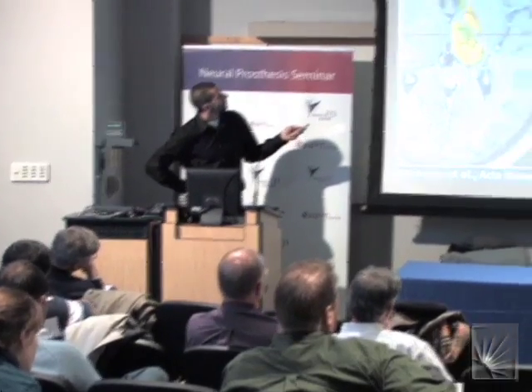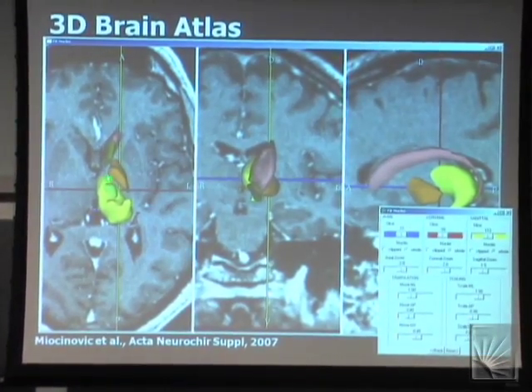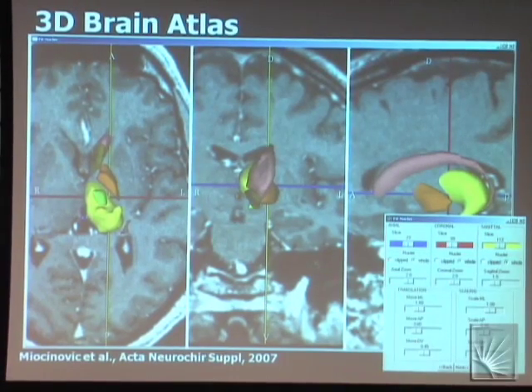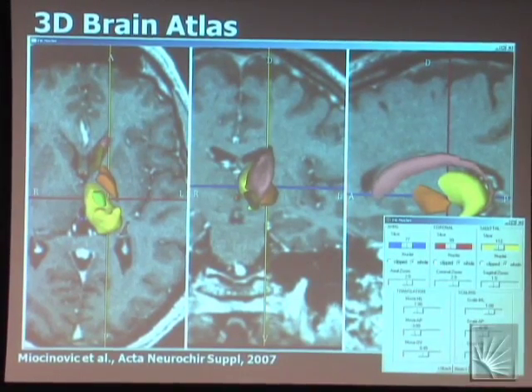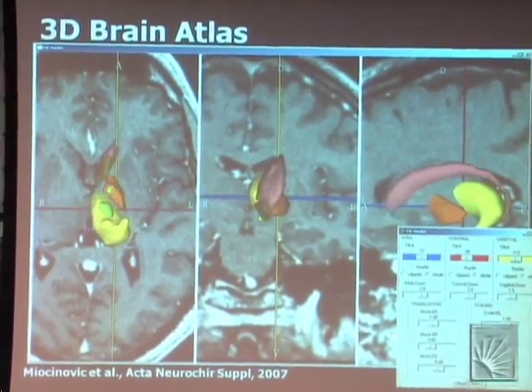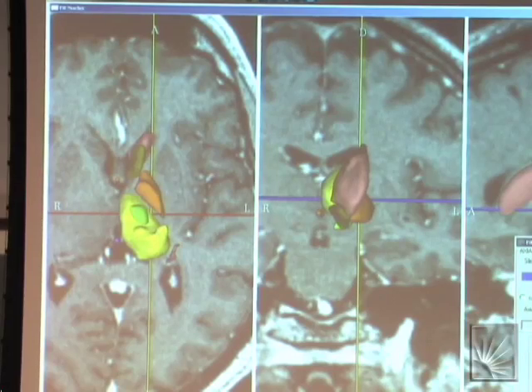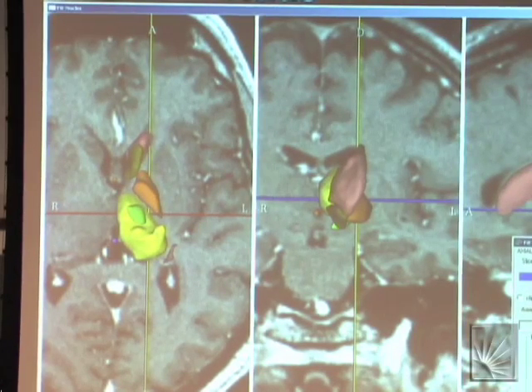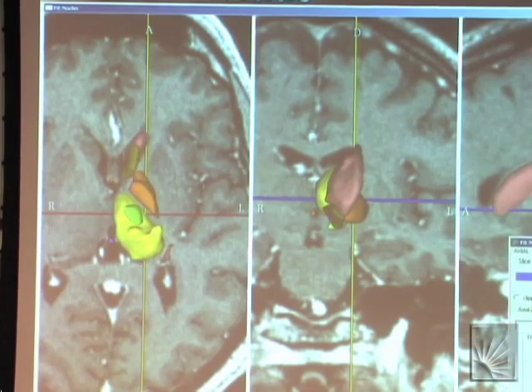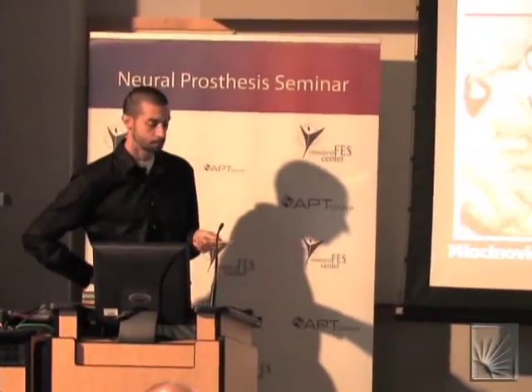Okay, so the lenticular fasciculus is a fiber tract that runs from the globus pallidus internal segment, above the STN and then into the thalamus. There are two fiber pathways coming from the globus pallidus internus into thalamus. One is called the lenticular fasciculus, the other is called the ansa lenticularis. The ansa lenticularis is going in a different trajectory. It's not really part of this equation. But half of the output fibers from the GPi are going to thalamus right by this STN DBS electrode.